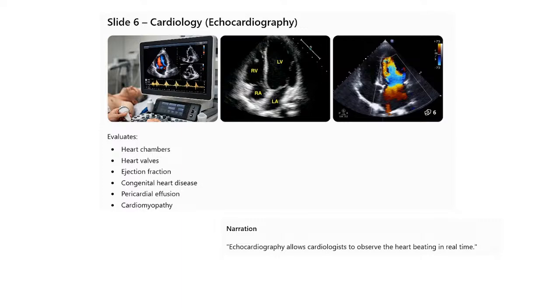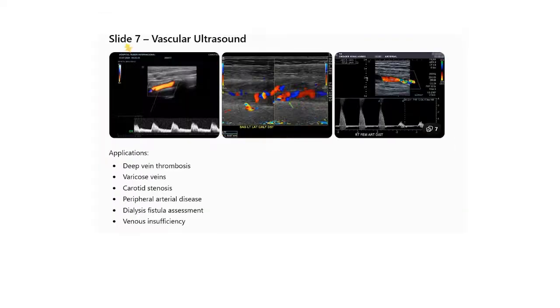So the cardiology or echocardiography application of medical ultrasound. It evaluates the heart chambers, the heart valves, ejection fraction, congenital heart disease, pericardial effusions, and cardiomyopathies. So the narration: echocardiography allows cardiologists to observe the heart beating in real time. So the vascular application of medical ultrasound. Applications: deep venous thrombosis, varicose veins, carotid stenosis, peripheral artery disease, dialysis fistula assessment, venous insufficiency.